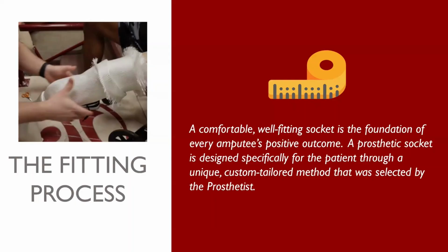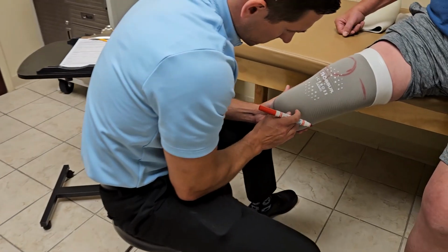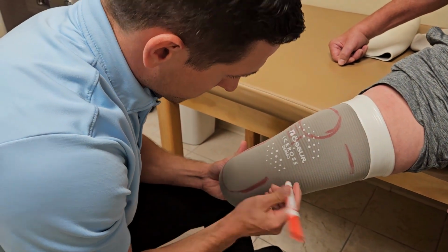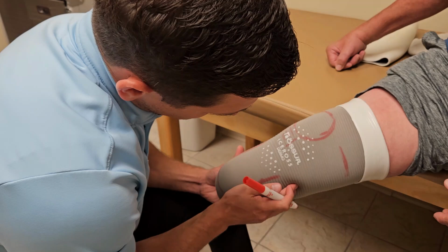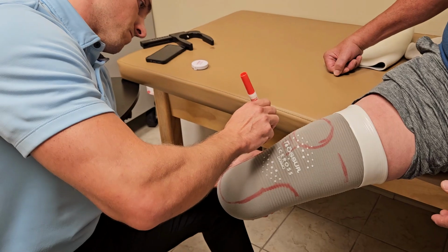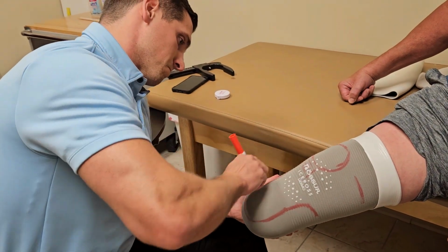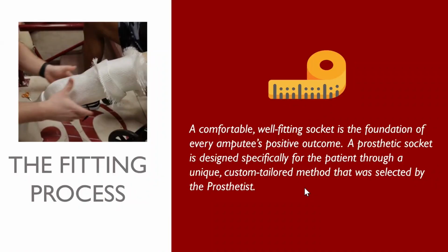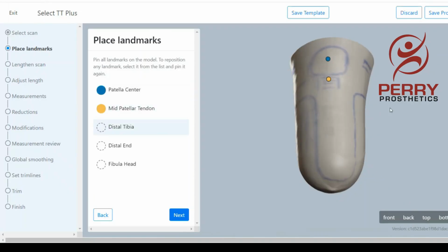Go ahead, Mike, Theron. Yeah. So the fitting process, obviously, our goal is to get a comfortable, well-fitting prosthesis that is, firstly, comfortable and then functional. A lot of people wonder why, when somebody comes to us with a prosthesis from somewhere else, we can make some adjustments to try to get them by, but many times doing adjustments after you've already poured the foundation is very difficult to get good results. But we have had some success. The basic socket design, though, dictates a lot of what you can do after that.